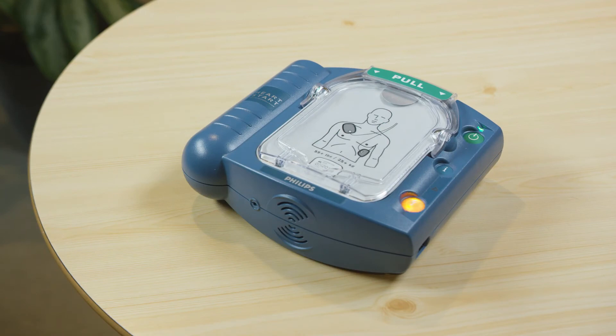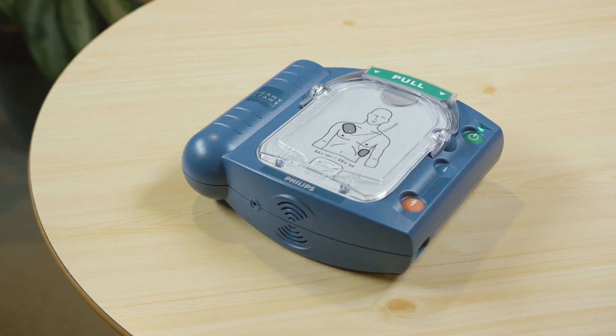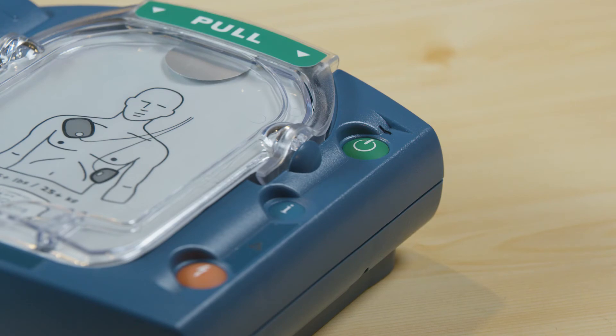If the orange button is flashing, press it. After passing the self-test, your AED will be in standby mode and ready for use. All you need to do is make sure the green light is blinking.